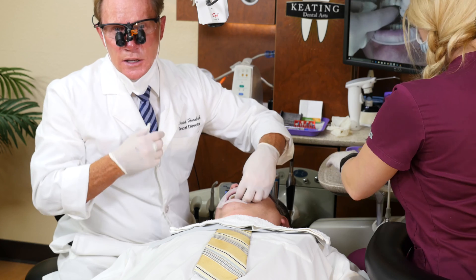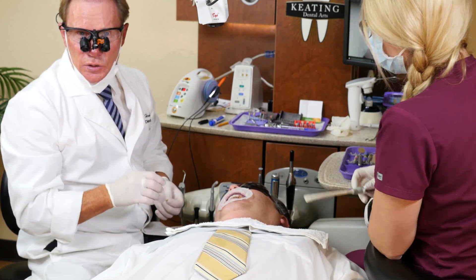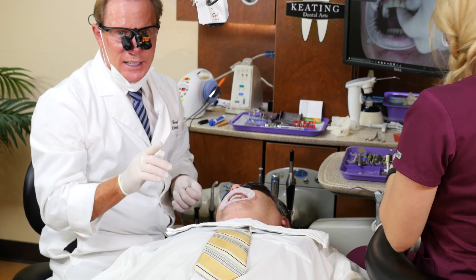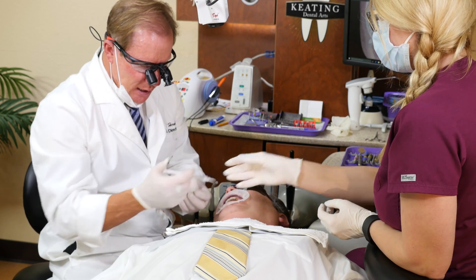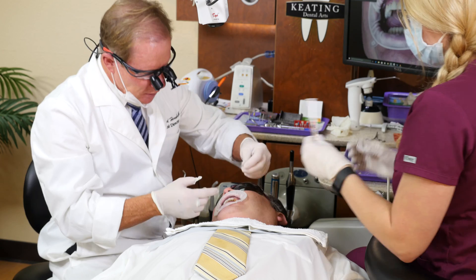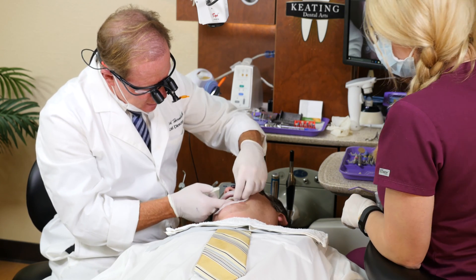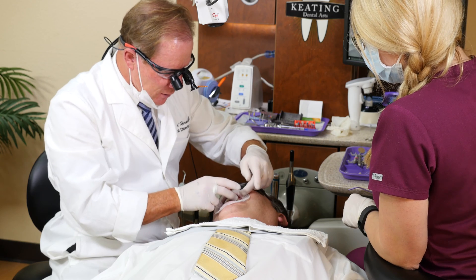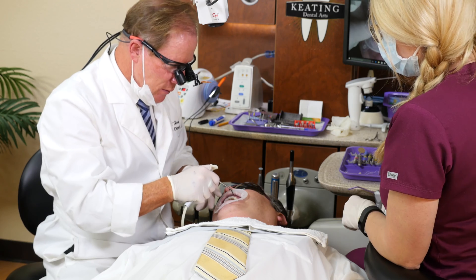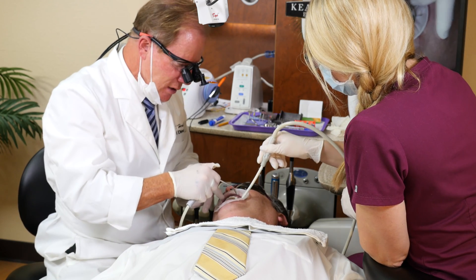Because this is zirconium, it has a relatively translucent core. I want to try it in with glycerin to make sure we like the color, because we can modify shade very slightly with different shades of resin cement. So I like to try it in with glycerin first — that's actually Deox, D-E-O-X from Ultradent Products. I'll try it in with clear so that I can use a clear cement, which won't influence the shade at all. Pretty straightforward shade matching his existing.